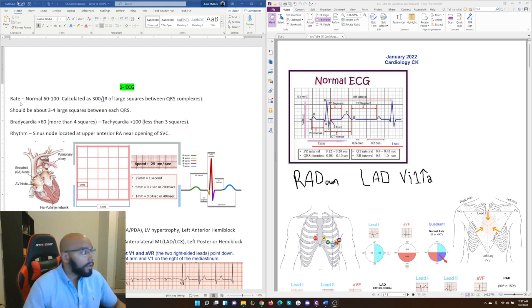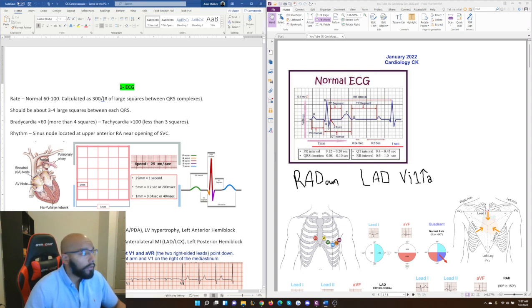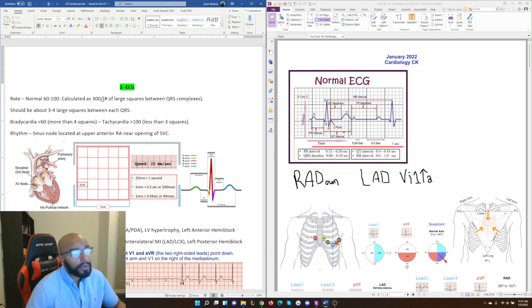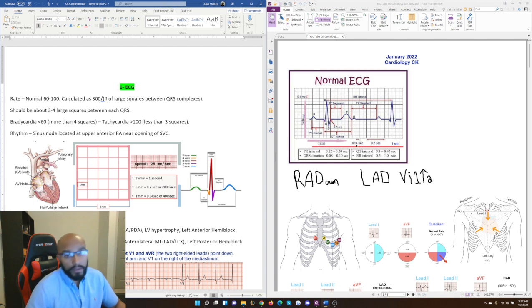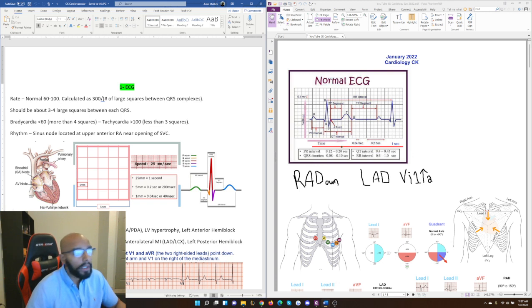The normal heart rate is 60 to 100. To calculate it, divide 300 by the number of large squares between QRS complexes. Looking at the image, the large squares have solid lines, and each large square contains five little squares. Each little square is 0.04 seconds, and one large square is 0.2 seconds. Going through five large squares gives you one second — five times 0.2 equals one — so the red line I drew here annotates one second.